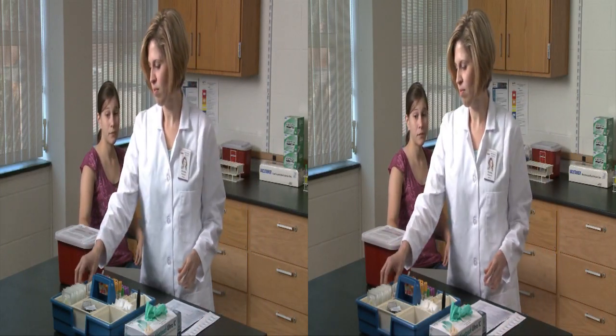Blood collection by venipuncture is one of the most common procedures performed in a health care setting.